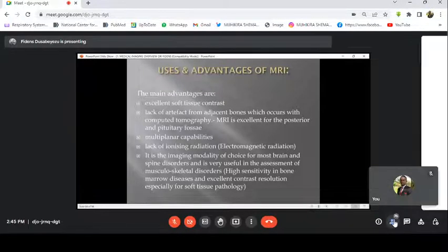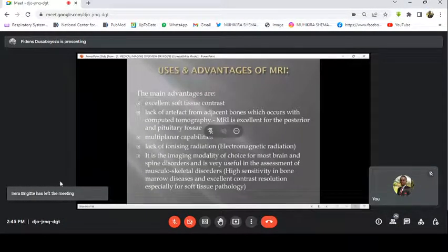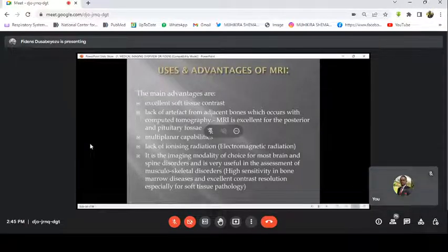Can you ask? We want to know about the colors identification. Because I don't want to go into it, first of all, it is very complex for you. Secondly, you cannot even understand it. You change the sequences for you to analyze any structure in the body. That's how the machine functions. You change the sequence, what you call sequences, the way the machine works, so that you can recognize anything.